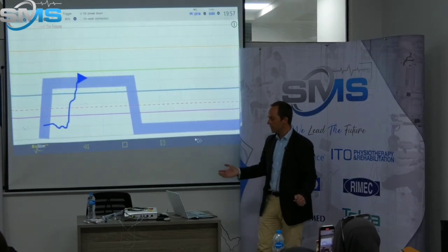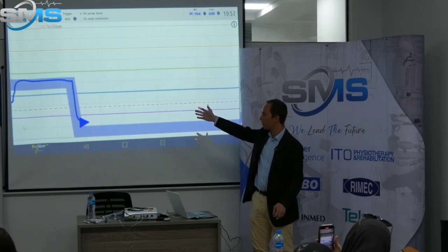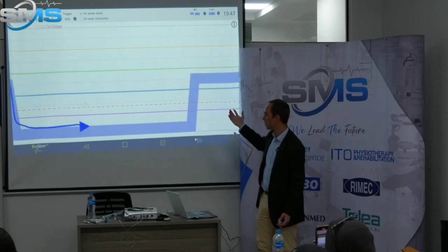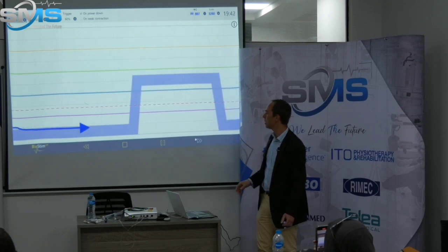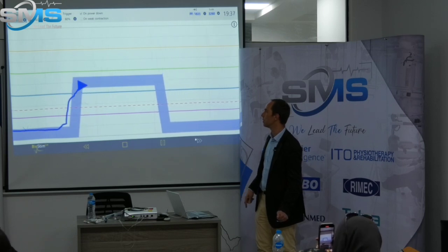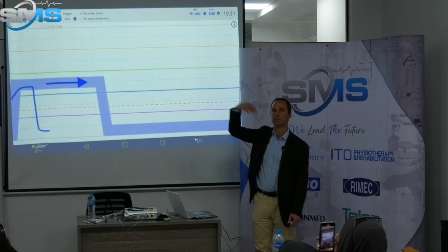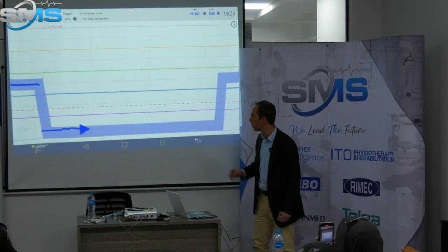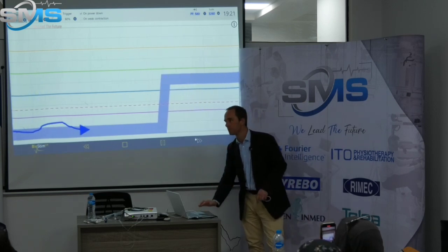So here, let's imagine first time, beginning of the session, it's okay, we can see she's following the path very well, good relaxation, everything's good, nothing to say. But after, let's say 5, 10 or more minutes, when she has to contract, she starts with a good, but she's too tired and relaxes. Here, you see, the stimulation takes the lead, and we can have a good combination of both. This way, she's doing the best she can, and she's helped by the device.